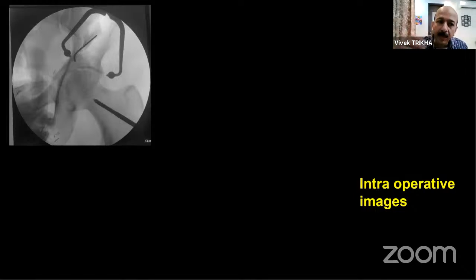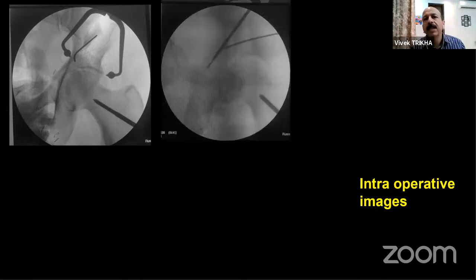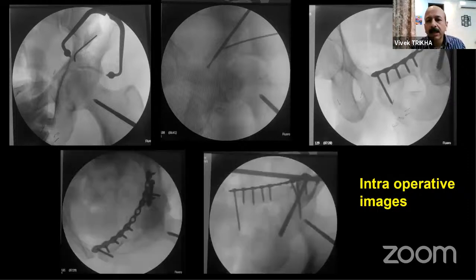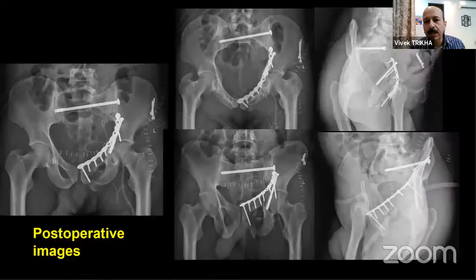Then coming from the lateral side, as well as the symphysial area, intrapelvic, you can fix and reduce your quadrilateral plate, the anterior column and the posterior column. This screw, with reduction from the quadrilateral plate region, has been put from the lateral window. And then you go anteriorly, fix your plate completely towards the front, and you can get the fixation you want. I'm showing you evolutions, how you improve upon the complexity of cases so that you can learn and master this approach, because this is the approach of the future.